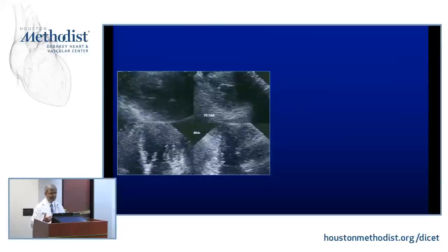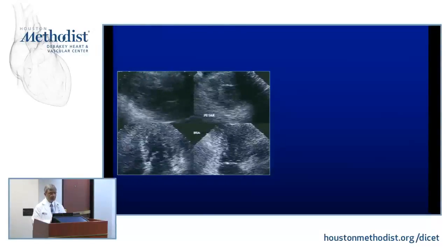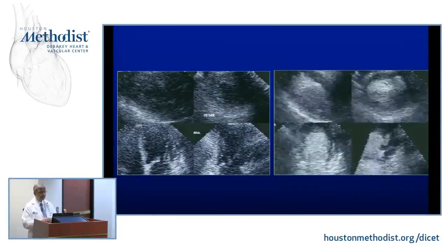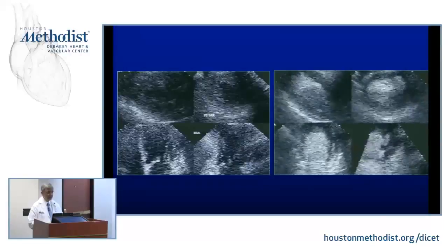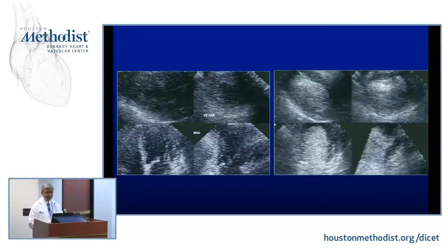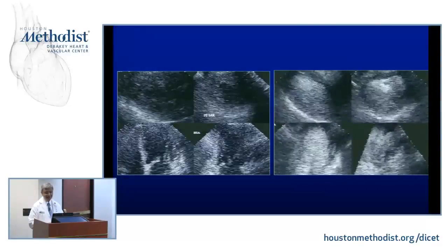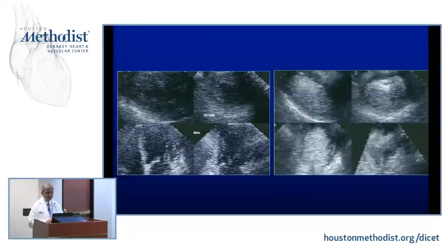Patient had a very abnormal electrocardiogram with what looks like an infarct. And it was amazing to me because the only area that was not really well visualized was about 2 o'clock. I've never seen a localized aneurysm just in the lateral wall and sparing the apex.